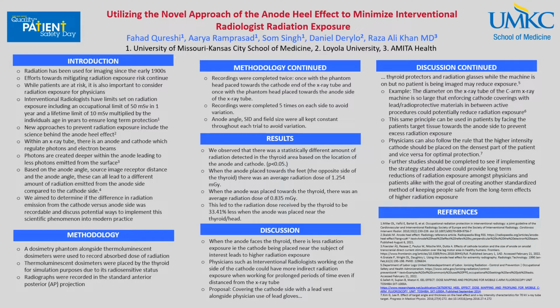Radiation has been used for imaging since the early 1900s, with continued efforts over the years towards solutions in mitigating the risk of radiation exposure. While we know that patients are at risk due to increasing use of imaging over the past 20 years, it's also important that we consider the radiation exposure that many physicians experience.